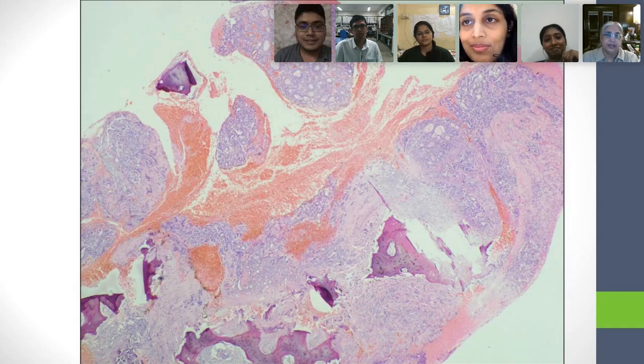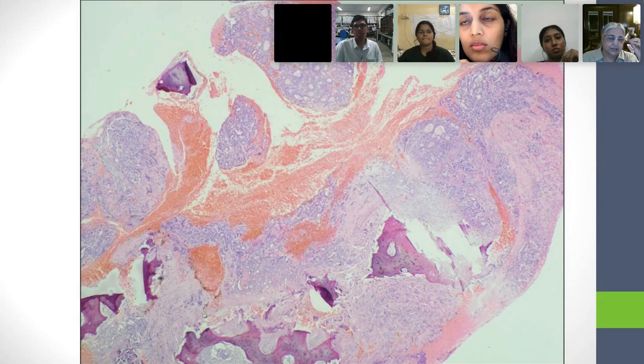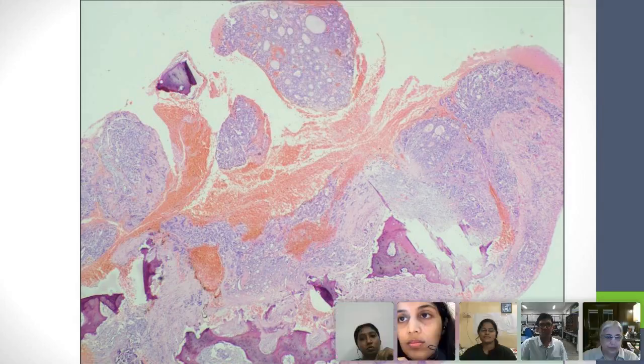I'm absolutely certain, and it doesn't make any difference to me. All ameloblastomas have got the same propensity to undergo malignant transformation, and it doesn't matter to me whether this is acanthomatous or follicular or any type of ameloblastoma. It's the same. And certainly from this biopsy, I'm not going to make a diagnosis of the type of ameloblastoma. The dental people are obsessed with types of ameloblastoma because obviously that's an odontogenic tumor that they see a lot about.